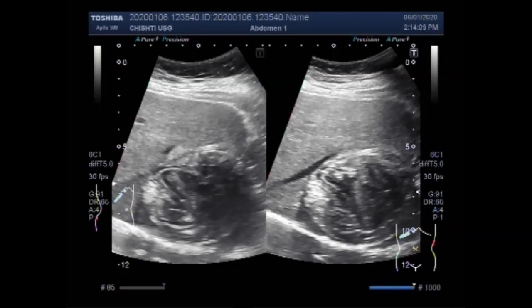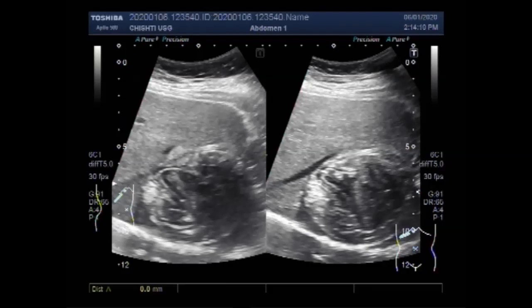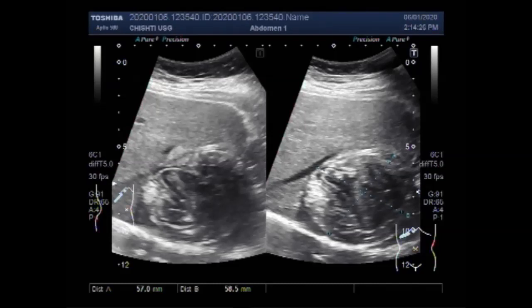You can see the measurement of the hepatic hydatid mass, and in this position it measures about 5.9 cm. This is the liver and this is the hepatic hydatid mass.